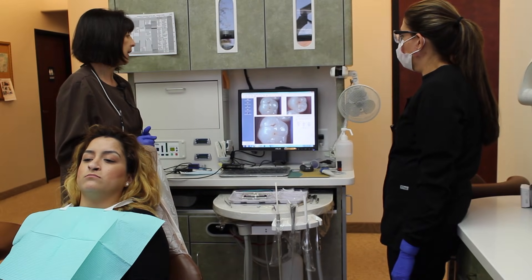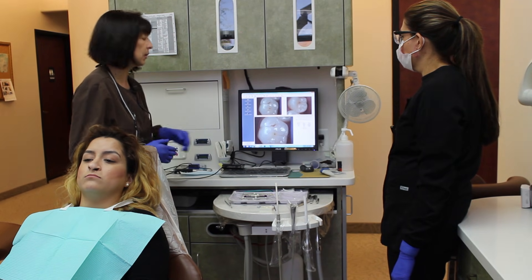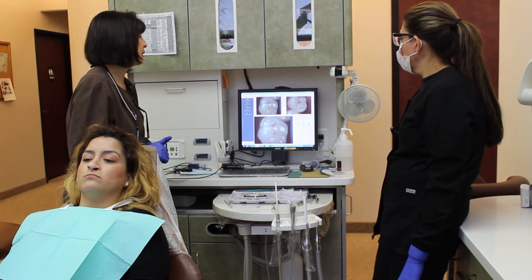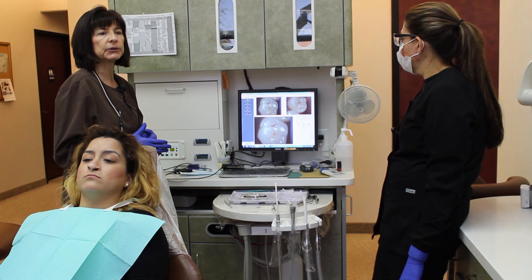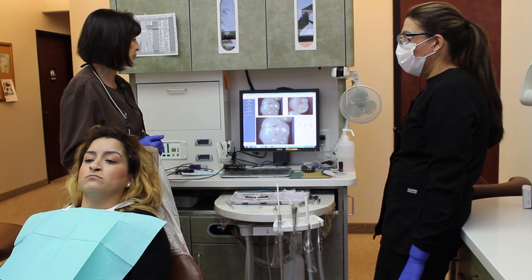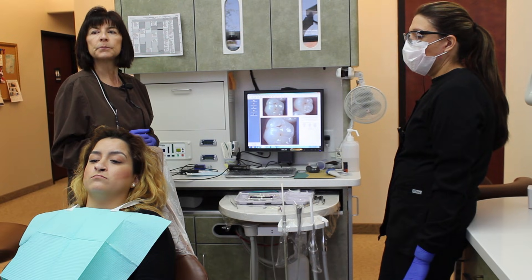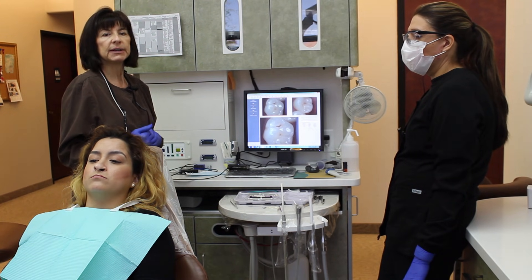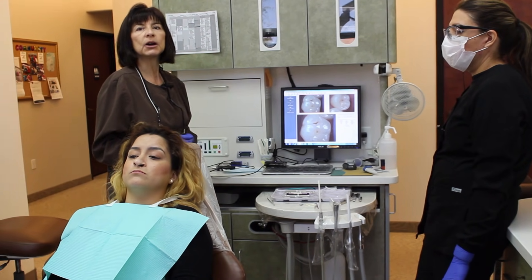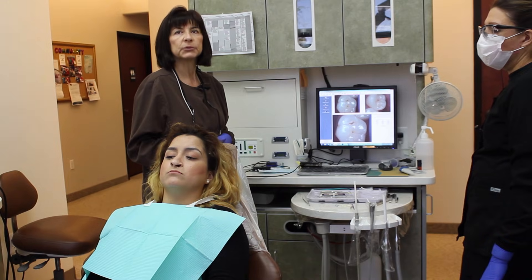No shots, no drilling, and it will enable me to keep the cavity very small and preserve all of this good tooth structure. Many times I'll have a patient come in, and if they had come in sooner I could have found their cavity at a small stage and done the air abrasion procedure. But it's not necessarily the philosophy of other offices to treat a cavity early — they sometimes just watch them a little too long, and at that point you have no choice but to numb the patient up and drill the cavity away.